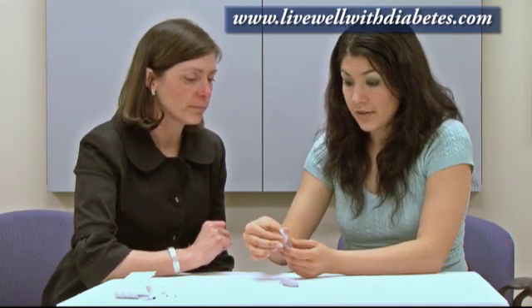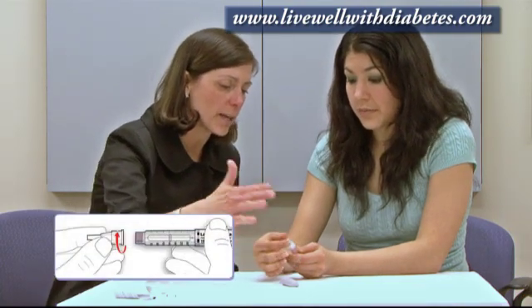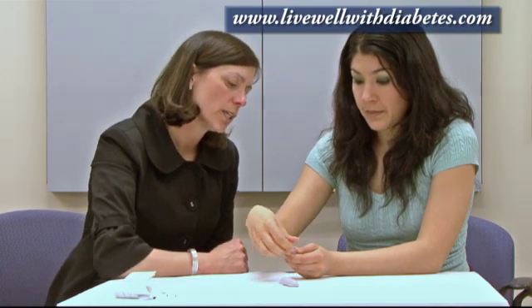Do you want to try taking the needle off? To take the needle off, you unscrew it. You put the hard plastic container over top and then unscrew it — it just starts to loosen and you pull it off.